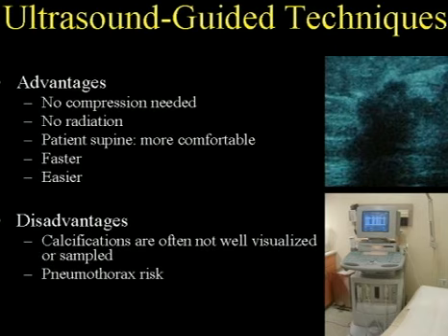I'll start with ultrasound-guided techniques. The major advantages with ultrasound-guided techniques are that there's no compression needed on the breast. There is no ionizing radiation used. Usually the patient is more comfortable because they are supine. We have here our ultrasound machine. The patient is usually on this examination table supine. And in general, this type of technique we've found to be faster and easier than techniques with mammography and MRI, although there is some difference with what you have available at your institution and what you're comfortable with.